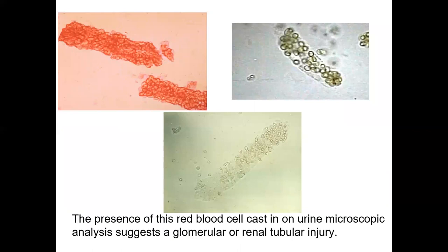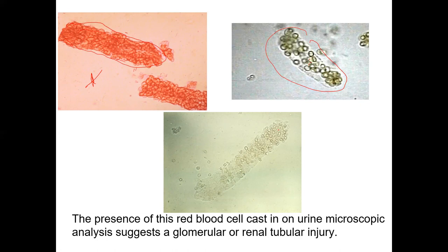These are red blood cell casts. You can see multiple red blood cells confined in a little tubule. The casts are usually surrounded by hyaline tissue — that's why they form the cast shape. It looks like a bunch of cells in one little cast — like a tootsie roll with stuff inside it. So these are red blood cell casts.